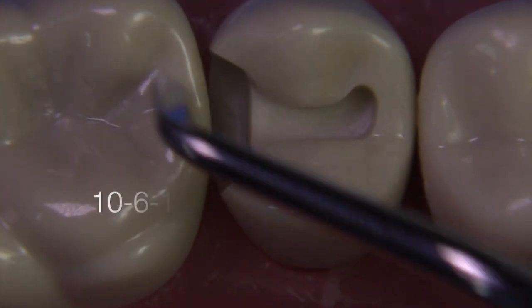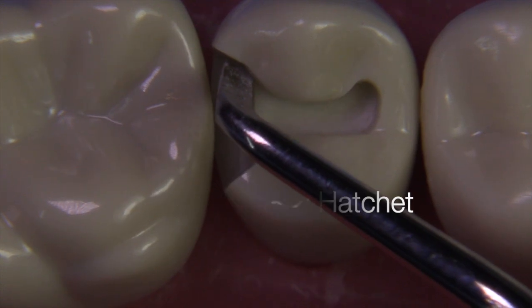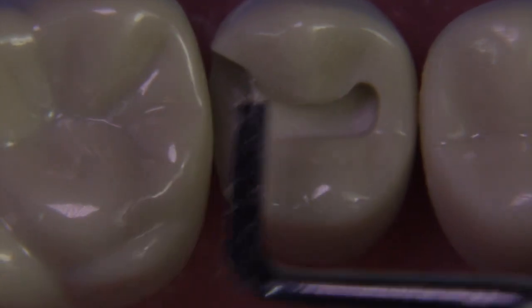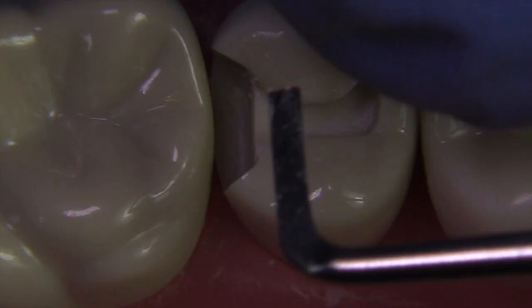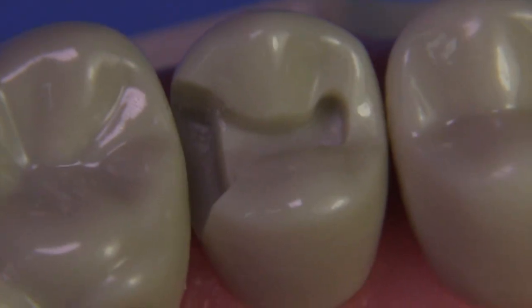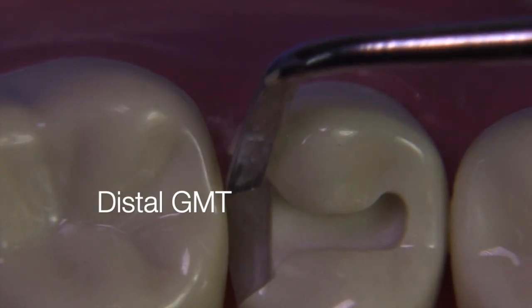Now it's time to refine the internal line angle with the hatchet. We use the hatchet in a downward motion, then slide it back towards that wall to complete the line angle — a really nice thing to do for a class 2 amalgam. These should be super sharp and defined. In some schools, you'll even need to put in a retention groove. In this prep, I placed retention grooves by virtue of making really sharp internal line angles. You really have to utilize a very sharp instrument.